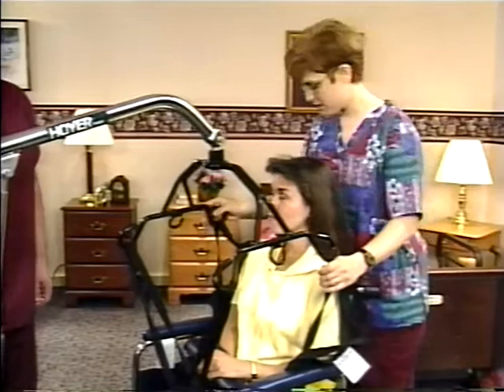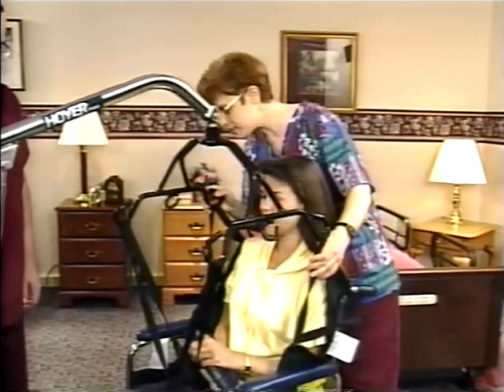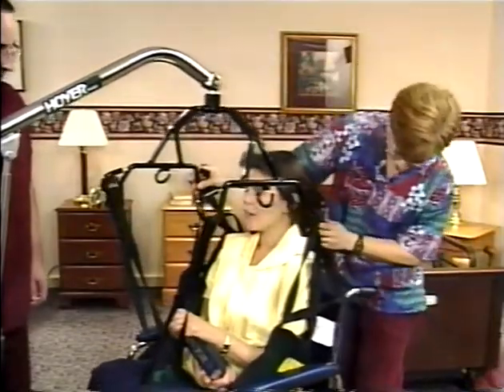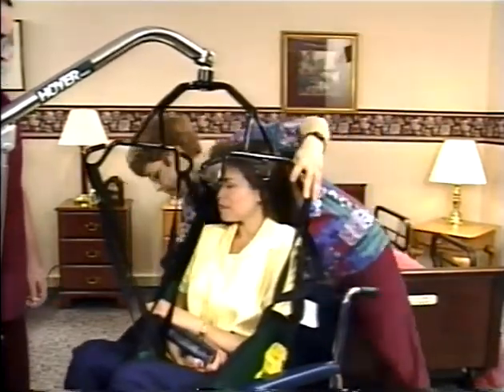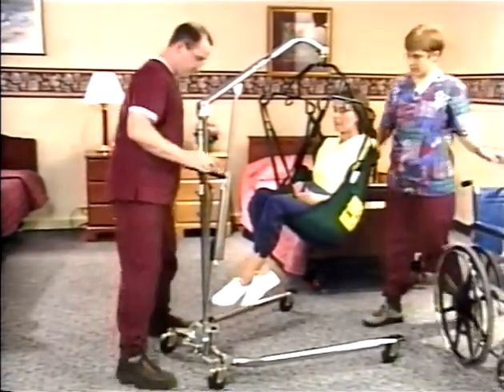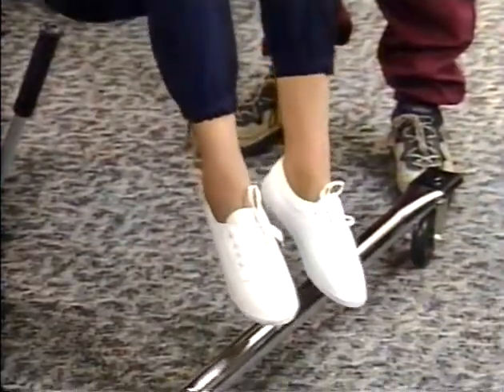While the operator gently raises the unit, the observer double-checks connections and makes sure the passenger is secure. Remember, never raise your resident any higher than necessary to complete your maneuver. It's uncomfortable and it can be dangerous. Once out of the chair, place her feet on the base for travel.